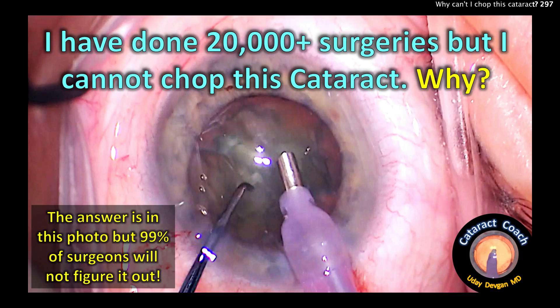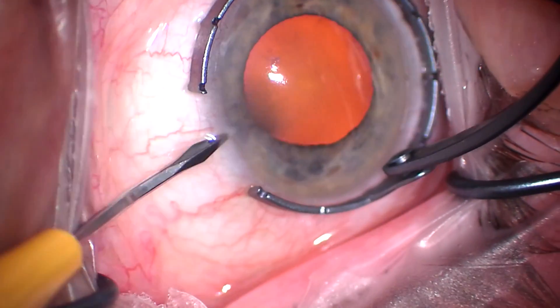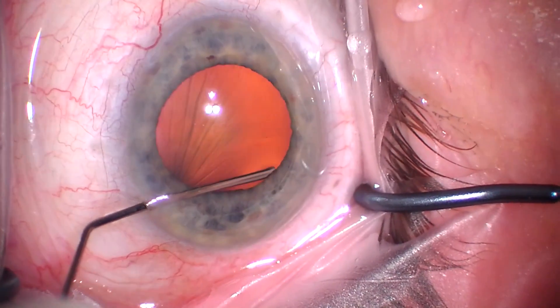cataractcoach.com. I've done 20,000 surgeries, but I just cannot chop this cataract. Why? 99% of surgeons won't figure it out from that picture. And how do I know? I didn't figure it out. And I'll show you the case.